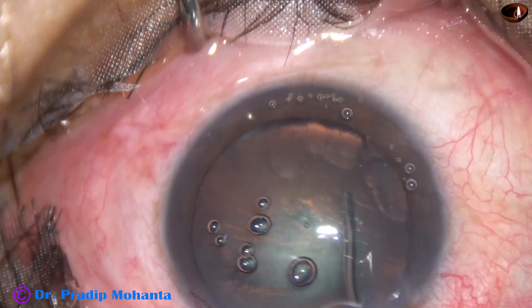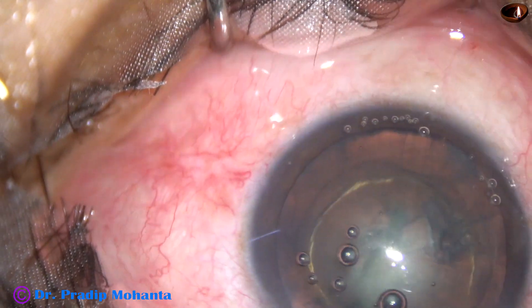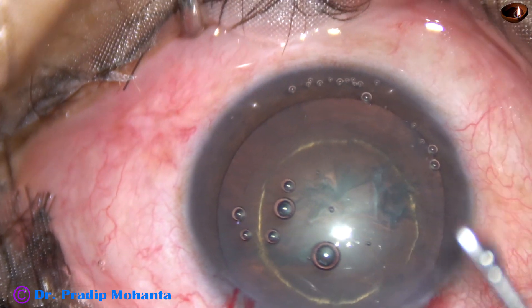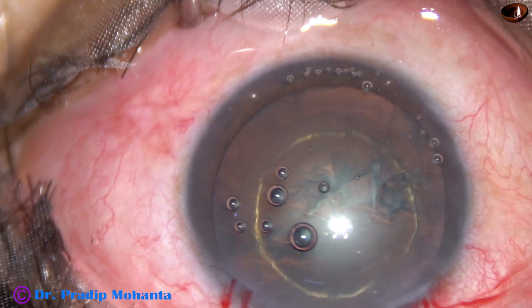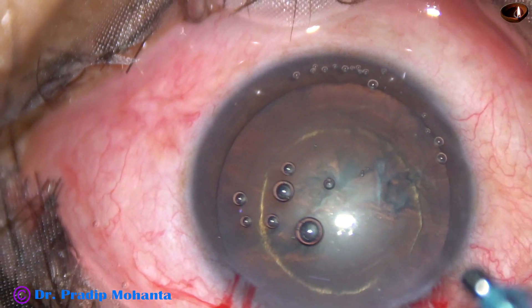If the nucleus is soft, as in this case, we can just do a nice hydro delineation, which will demarcate the nucleus. We can see this is a very small nucleus, so in this case we need not divide the nucleus. We can just pick it up and engulf it in one go, like this.